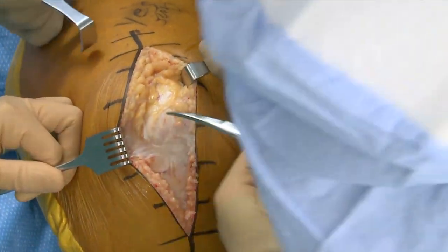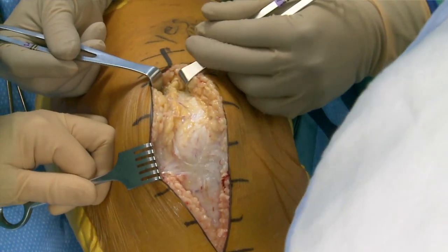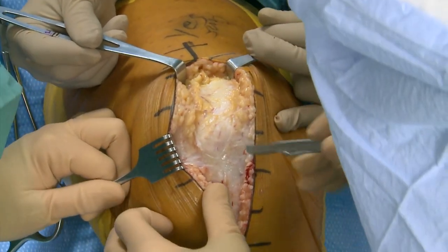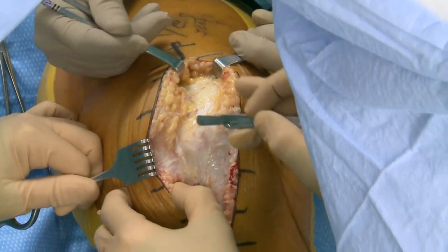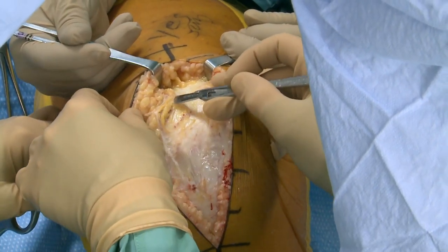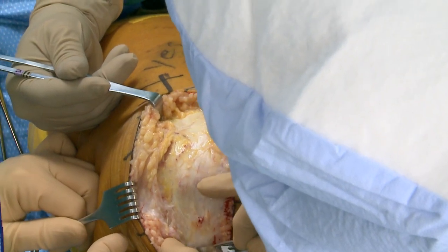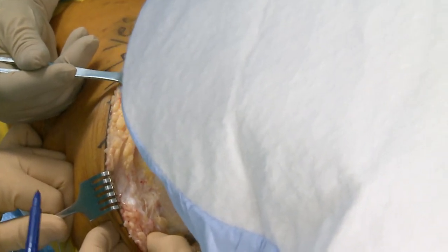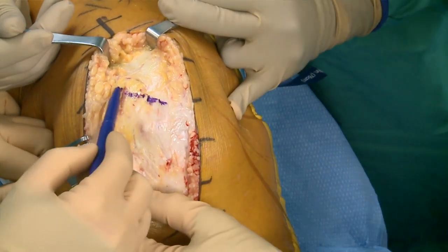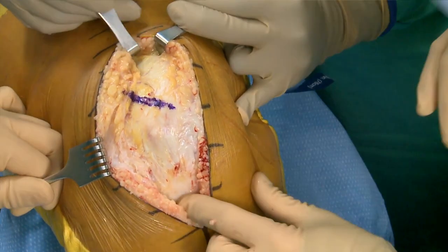Dr. Morrison is turning pretty much every case unless they have vascular disease, like one of the cases shown yesterday, or if they have a history of any venous VTE, DVT, or PE — then I will avoid the tourniquet on those patients as well. We mark our arthrotomy with a clean marker before we make it.